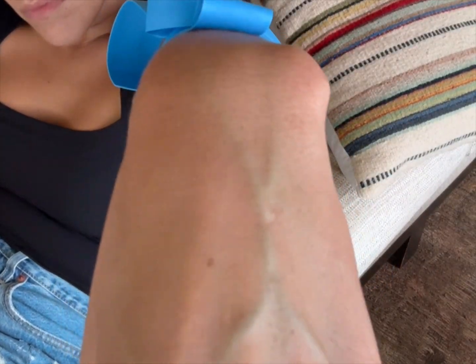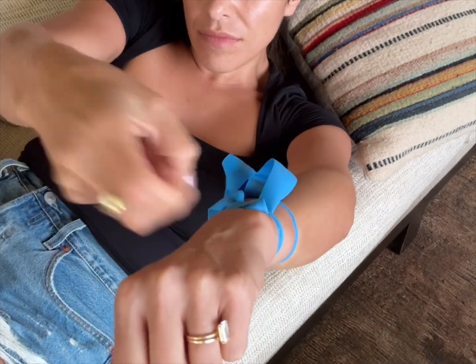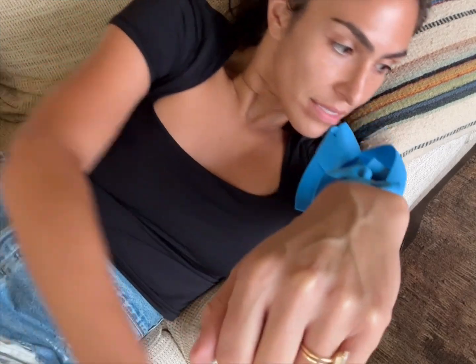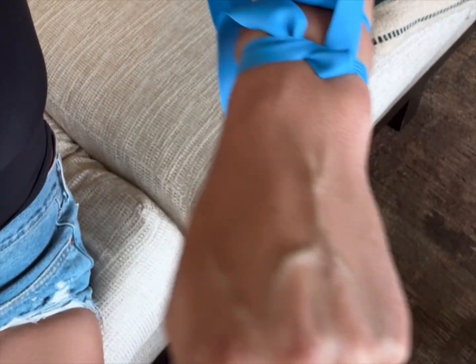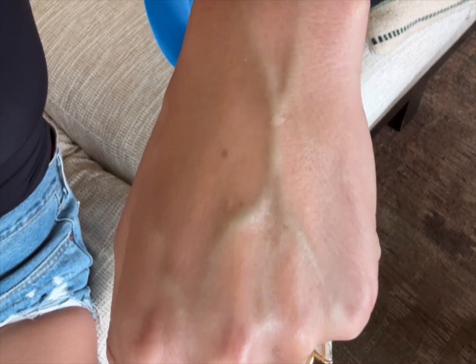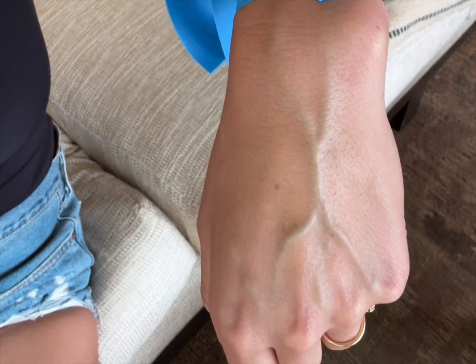Even without a tourniquet, you're going to get the veins to start getting a little bigger. Now let's see what it looks like with one tourniquet - and then two. You can see how two tourniquets make the vein even bigger. Now that the veins are large, you might say you can fit a 16 or 18 gauge in here - but what is it going to look like once we remove these tourniquets and I'm no longer in this position?